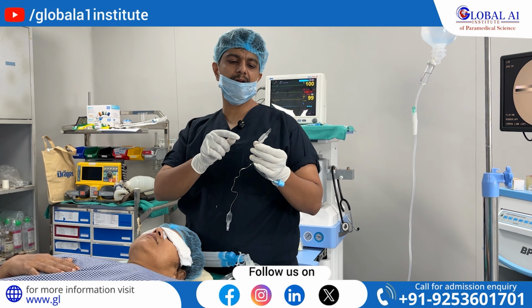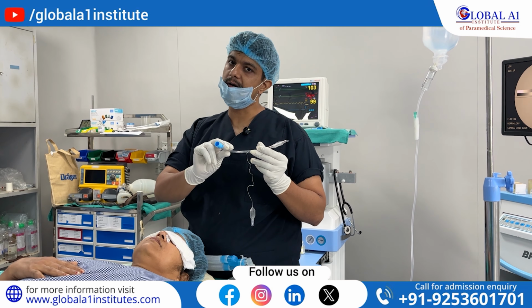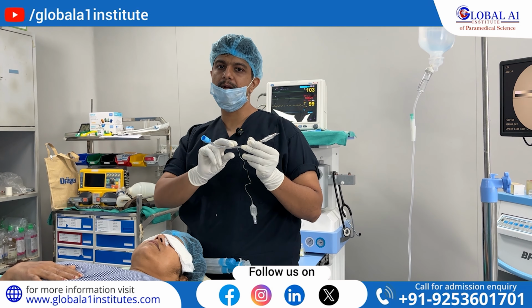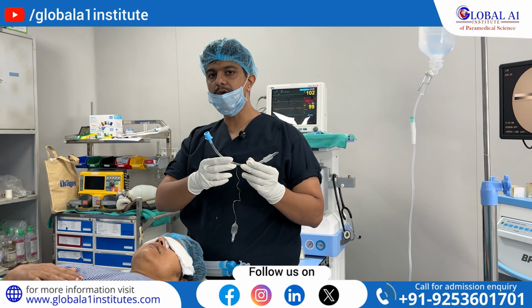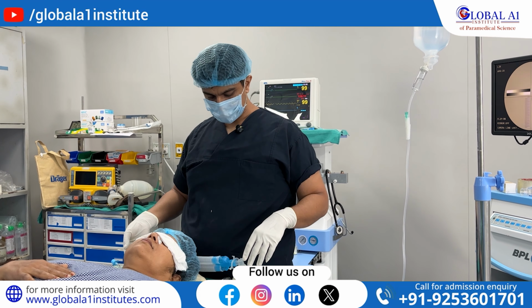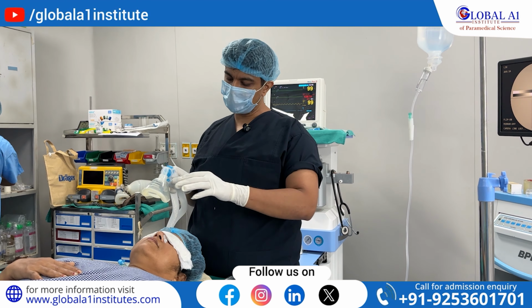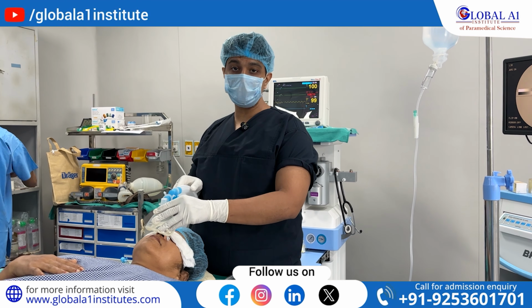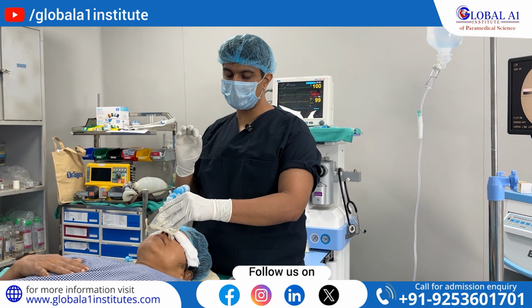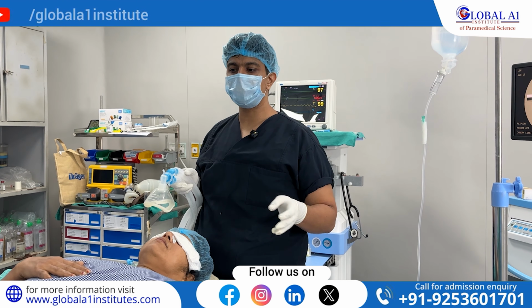You can see the cuff of it. There are many important parts of it, right? We will explain about it in the further videos. Okay, so now I am starting with the anesthesia. As you can see, in case of elective intubation, we have to pre-oxygenate the patient with 100% oxygen for at least 3 minutes, right? It will increase the FRC of the patient, right?